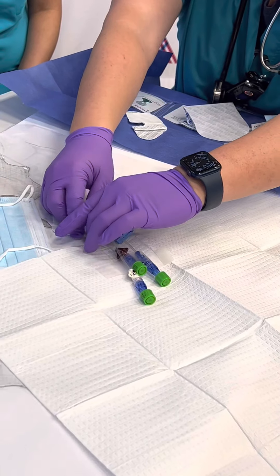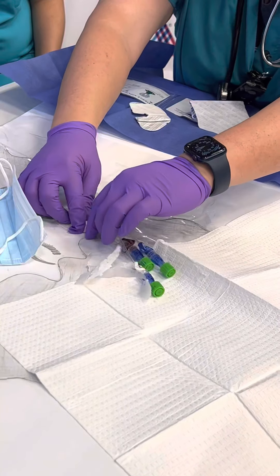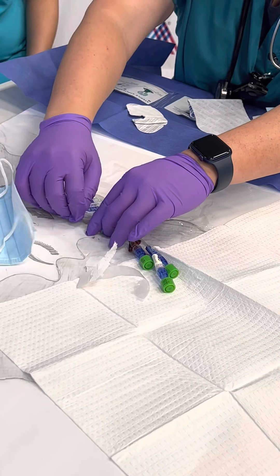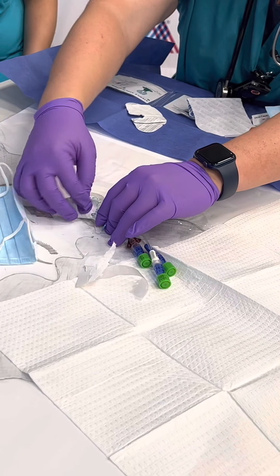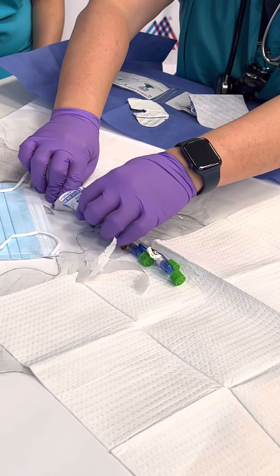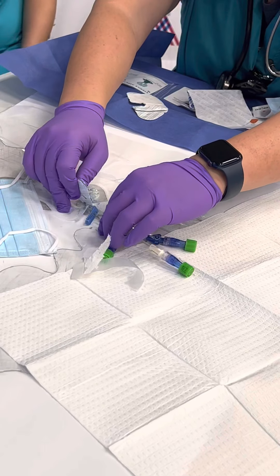At this point if you want to, you can take the tape off of this part just for easier use. Any questions about central lines? Pretty straightforward.